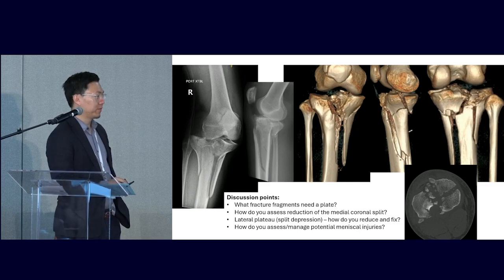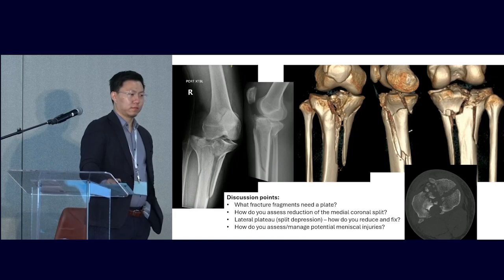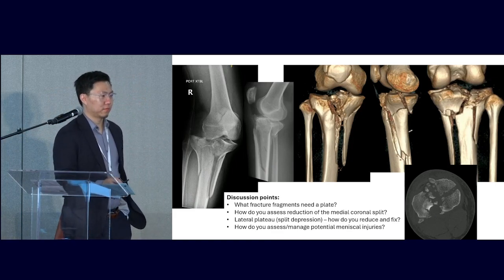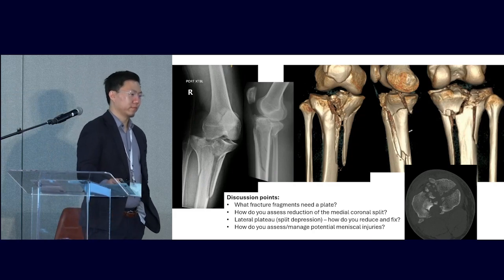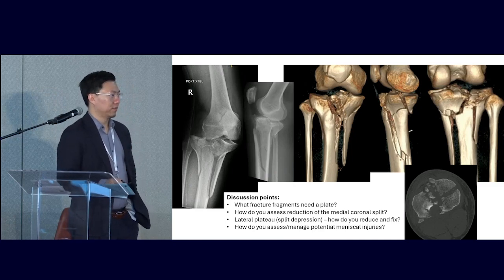Yeah. Because the question is the posterior medial fractures. In a trimal, if I'm going to plate the posterior medial, I prefer to have the patient prone, because it makes it so much easier. Yeah, so that posterior approach to the tibia is easier with the patient prone, but then you can't go around. To me, you've got to fix both sides, and it depends on the patient's hip motion and everything as well, but usually we'll have them leg free and work posterior medial and go lateral. Sometimes you have to go back and forth. You can't change a flat tire without a jack. Yeah, you can't do this without a femoral distractor.